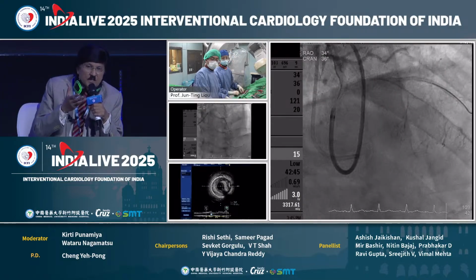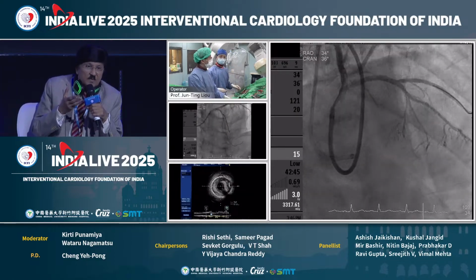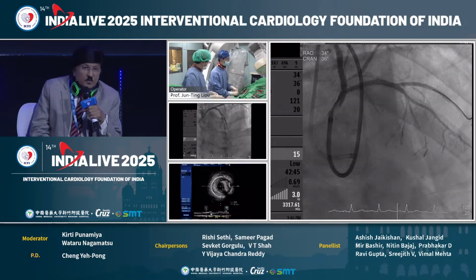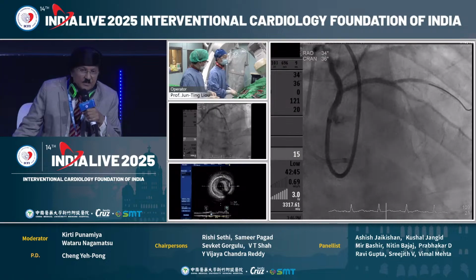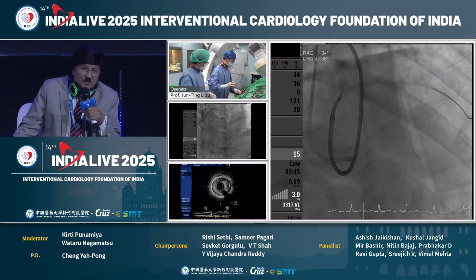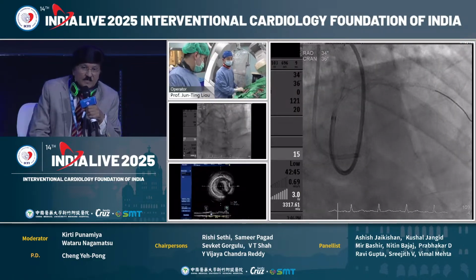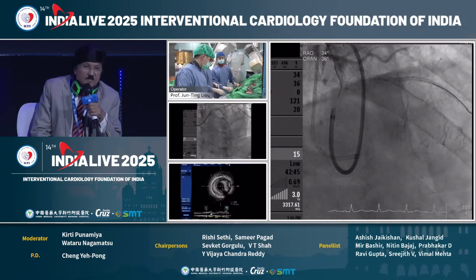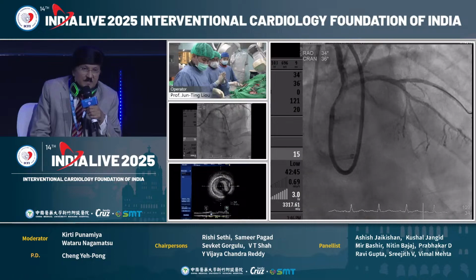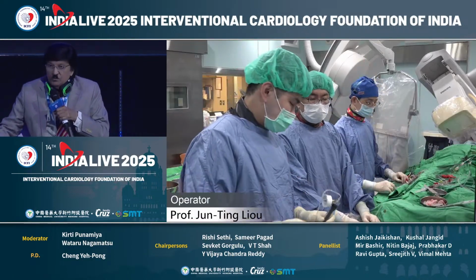So, have you finished, or will you do some more? Yes, we should do some post-dilatation. Yes, of course. And imaging, everything. Yeah, because we have finished our time schedule here for your case. And we'll go finally to the other case. But congratulations, and an excellent demonstration of a CTO antegrade approach. And we are thankful to you for showing us live pictures from there. Thank you very much. Bye. So we go to the other lab.